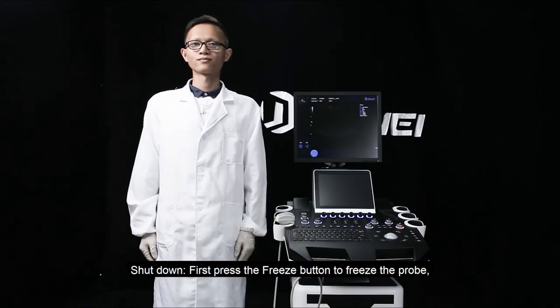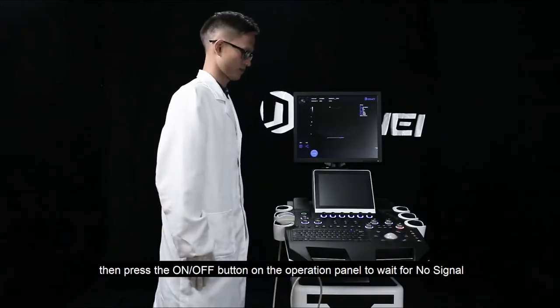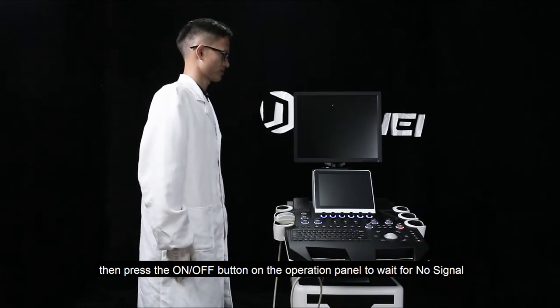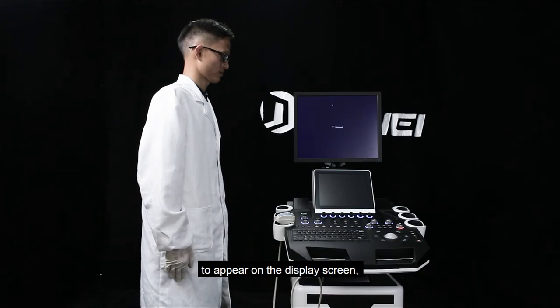Shut down. First, press the freeze button to freeze the probe. Then, press the on and off button on the operation panel to wait for no signal to appear on the display screen.